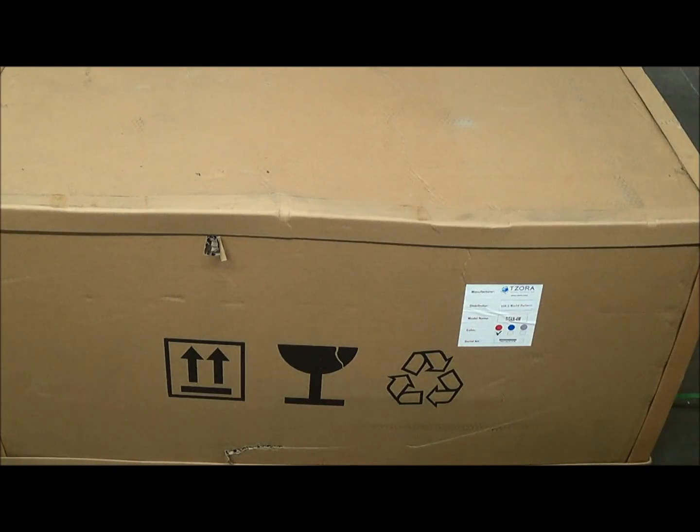Hi, I'm Dan at MobilityBuddies.com. We're a dealer for Zora Mobility Scooters. I'm going to show you how to unpack a Hummer XL or a Titan scooter that will come in this big box. It looks rather intimidating, but it's actually pretty simple.